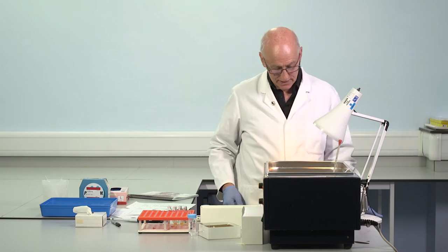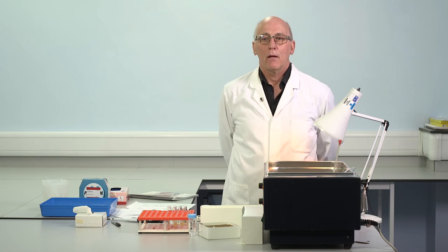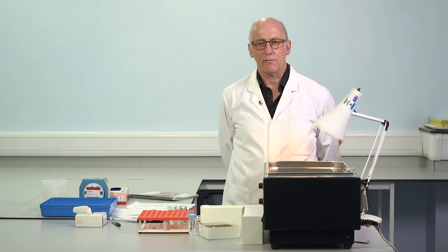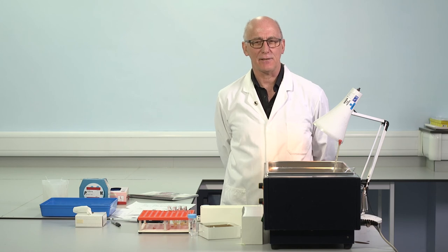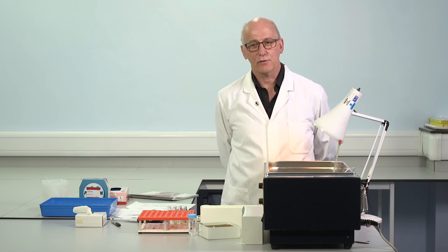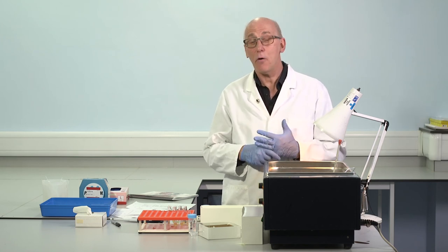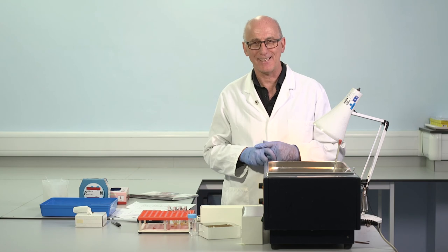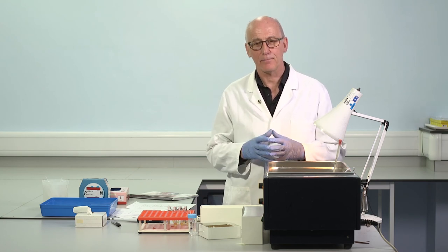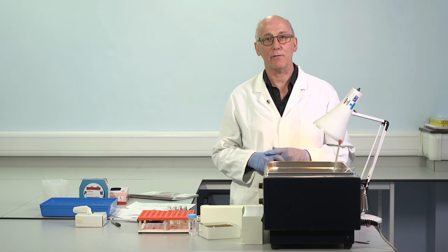And there is some variability between different APTT reagents in their sensitivity to the levels of factor VIII. The really poor reagents that were available many, many years ago have largely disappeared. So the majority of reagents currently available to us will usually give us prolonged APTTs for any levels of factor VIII below 30. In the 30 to 50 area, in that zone, let's say, getting up towards the reference range, then there is variability between reagents. So for most reagents, we will sometimes see a normal APTT in the presence of 40, 45 units per deciliter factor VIII. We have to keep that in mind. It's one reason why we can't use a normal APTT to exclude the presence of mild haemophilia or mild von Willebrand's disease.